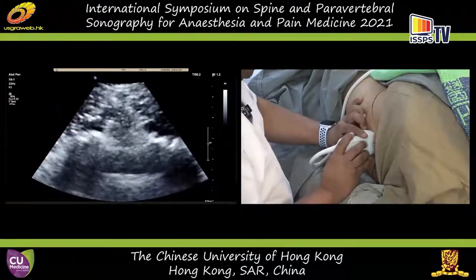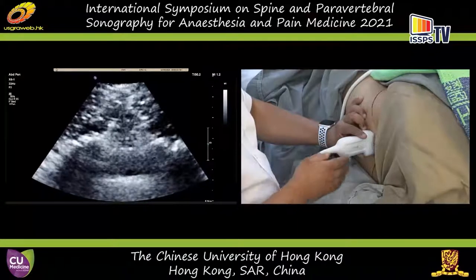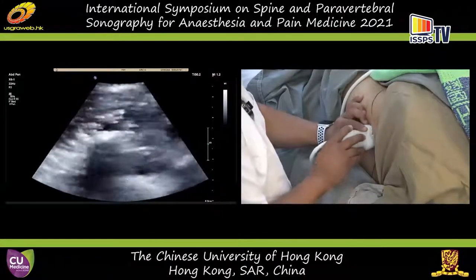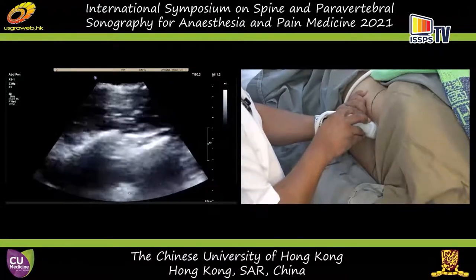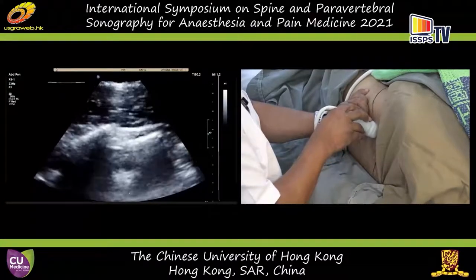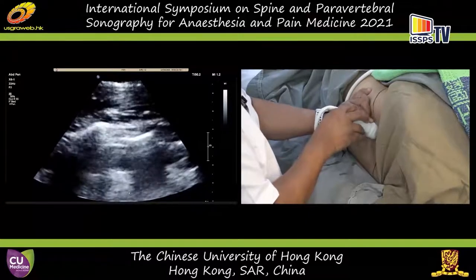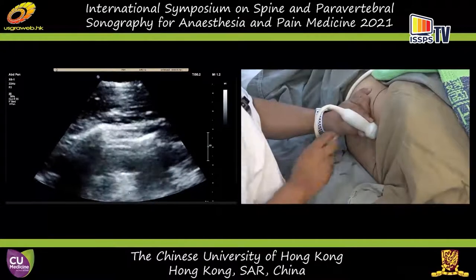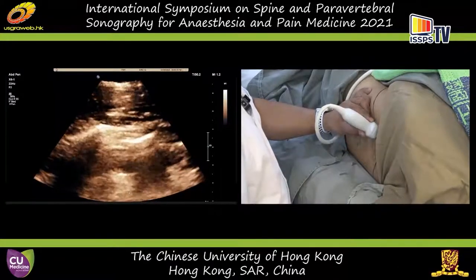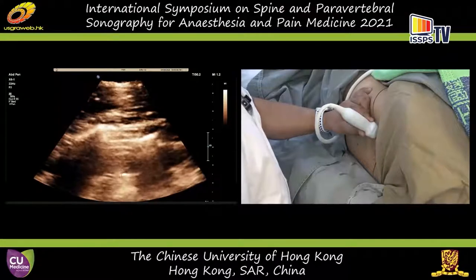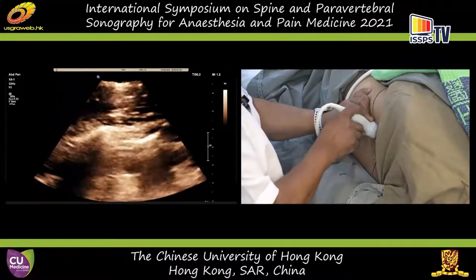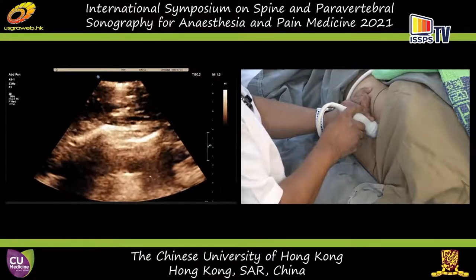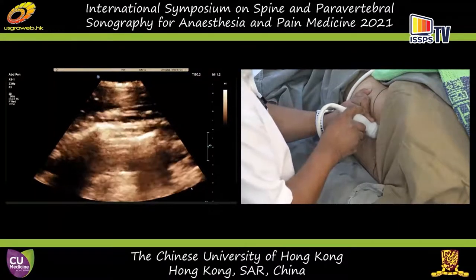The image is in the transverse view. I'm going to now switch it to the paramedian sagittal view and acquire the paramedian sagittal view. The Dura is much better now with this color. This is just a 2D view. I'd like you to see the number on the top left of the screen — it says 33 hertz.